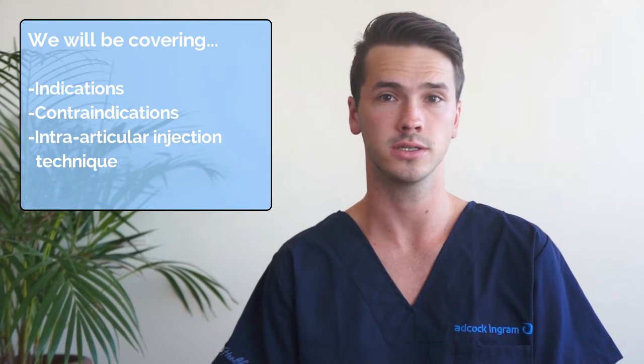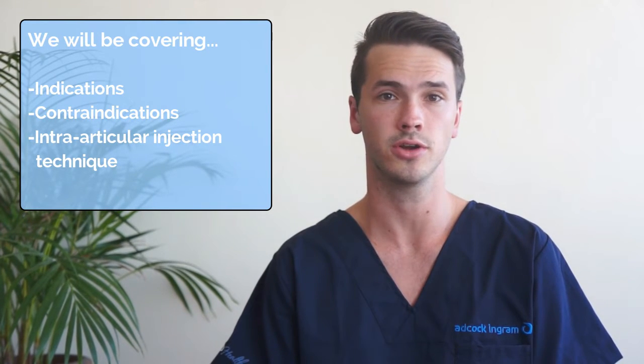A needle is inserted into a joint for two main indications: aspiration of fluid, also known as arthrocentesis, or injection of medications. This topic will review the basic technique of inserting a needle into a joint for both diagnostic and therapeutic reasons. It includes indications and contraindications, as well as a technical demonstration of an intra-articular injection, and will discuss the nuances of joint aspiration in contrast to intra-articular injections.